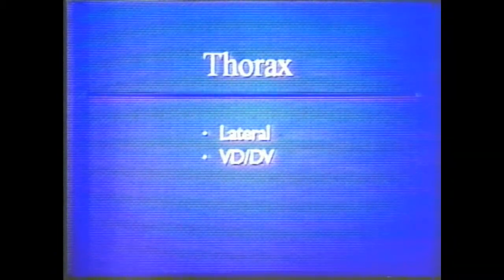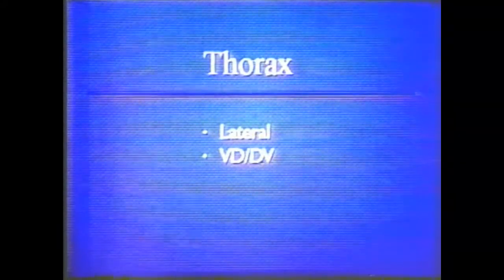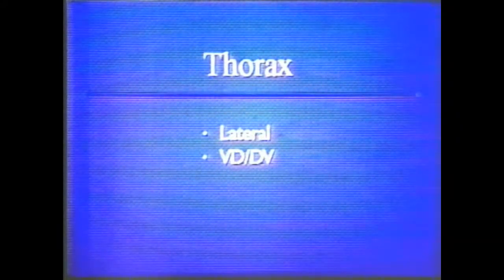There is the argument of which is the easiest to position, a DV or VD, and that may make a difference in your decision. The third criteria has to do with radiography of the animal that has severe dyspnea. It is normally less stressful to do those animals in a DV position rather than a VD.